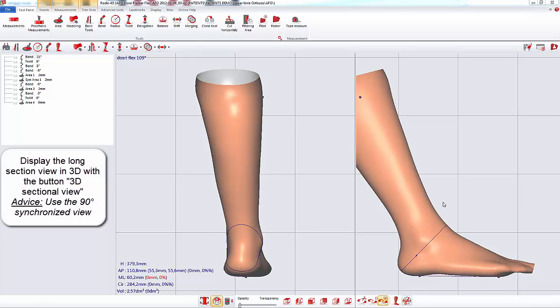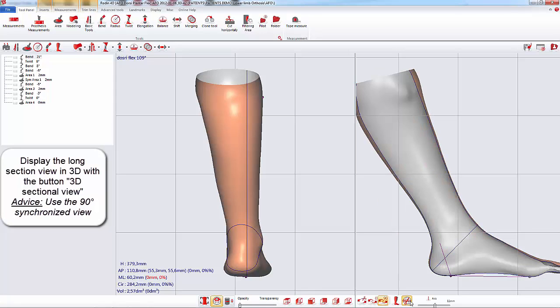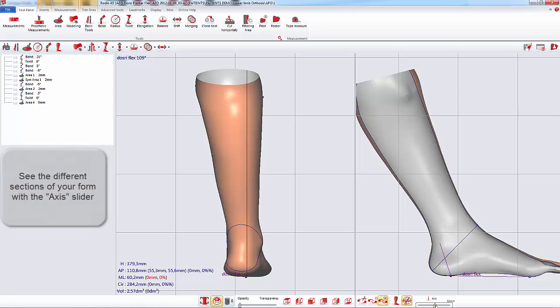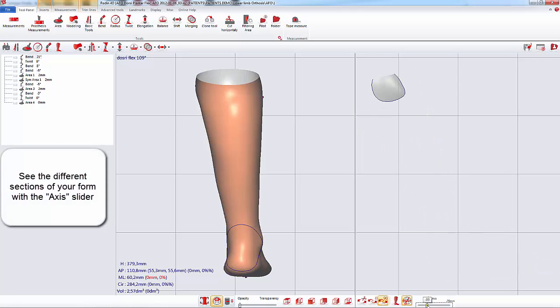With the 90 degrees locked auxiliary view, you can also view the sections of your form in 3D. With the slider, you see the different sections of your form.